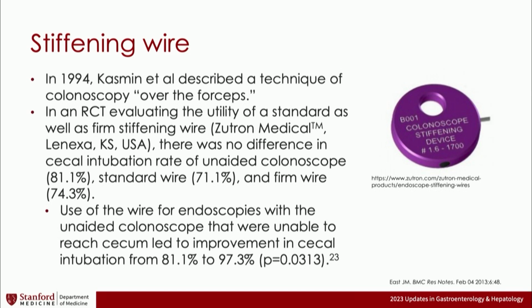However, when they looked at the unaided colonoscope that was unable to reach the cecum, they then utilized the regular or the firm stiffening wire. They found that they could improve cecal intubation from 81% to 97%.